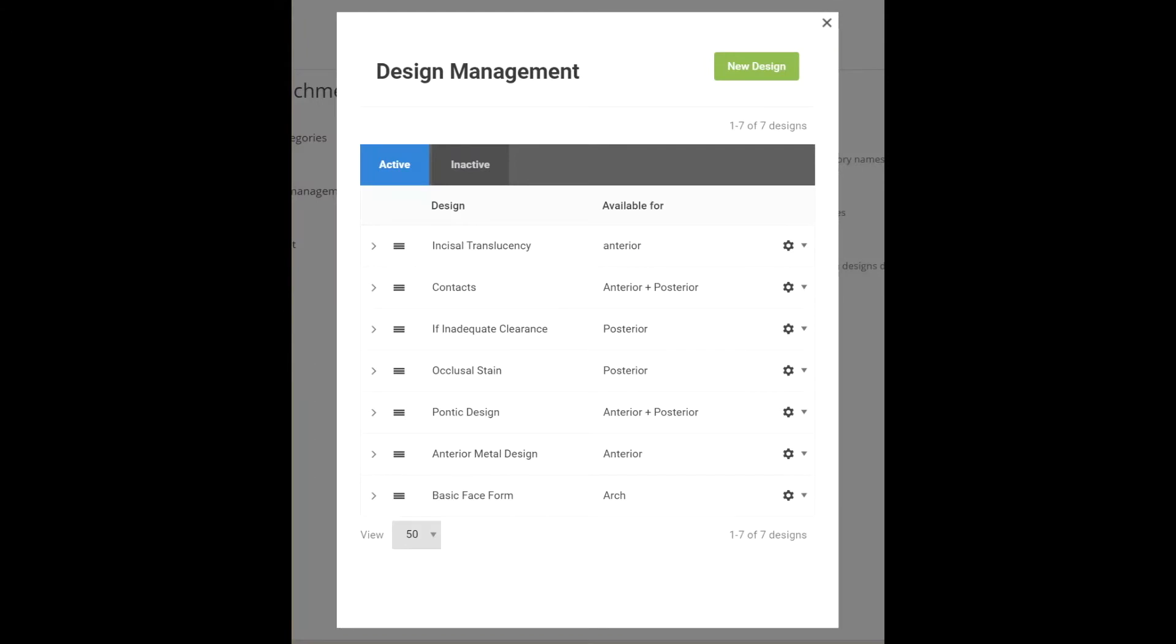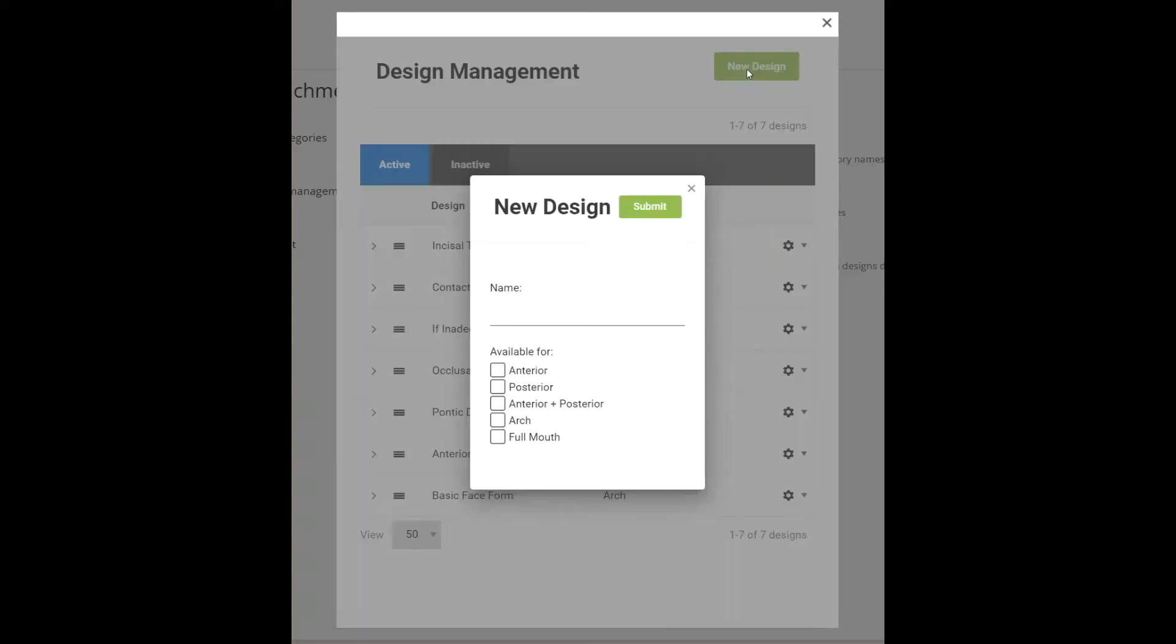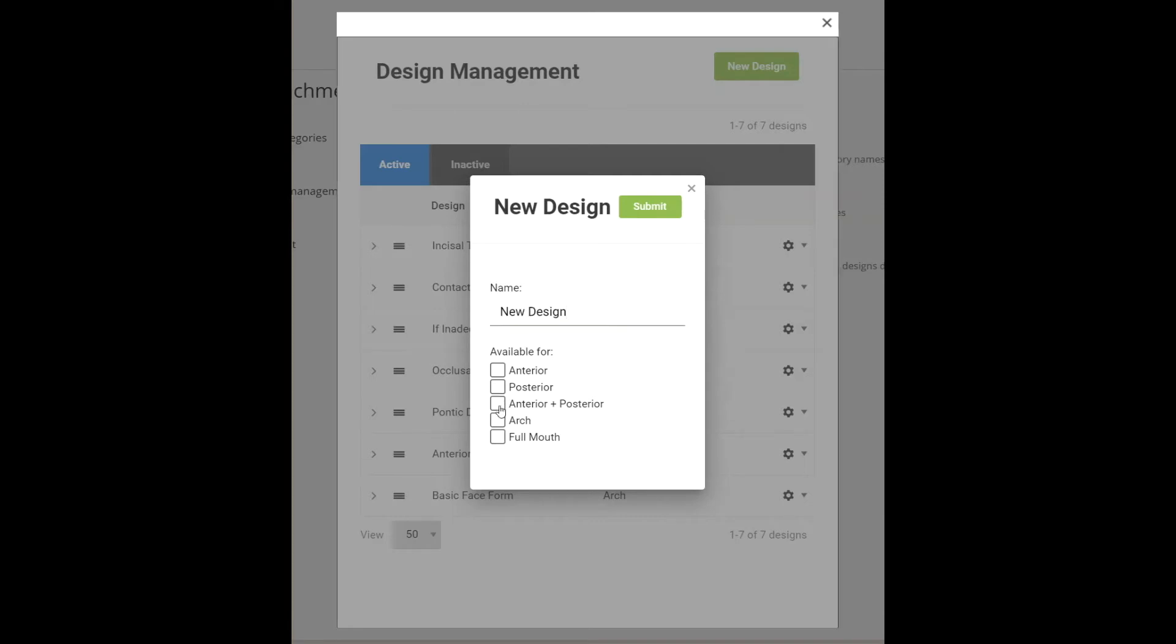To do so, go to Design Management in LabStar settings. Click on New Design to add a design name and select the type of teeth this design is available for: anterior, posterior, a combination, arches, or full mouth.